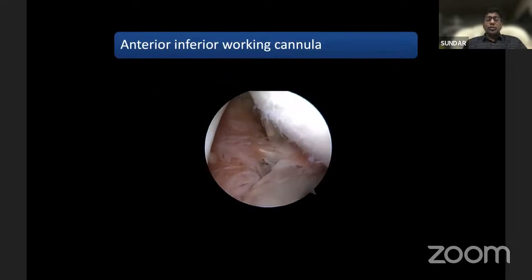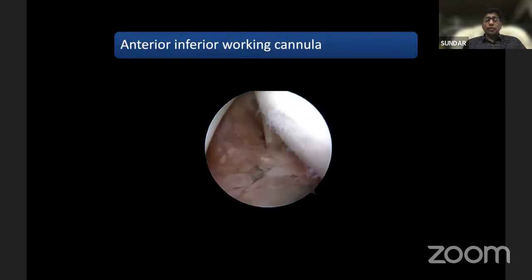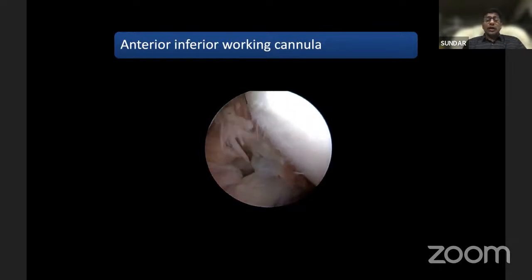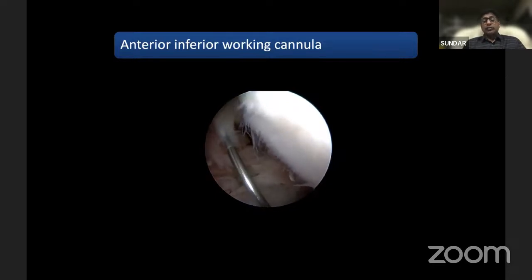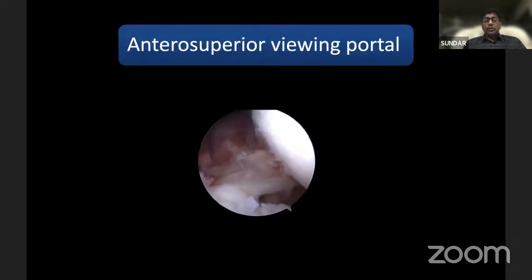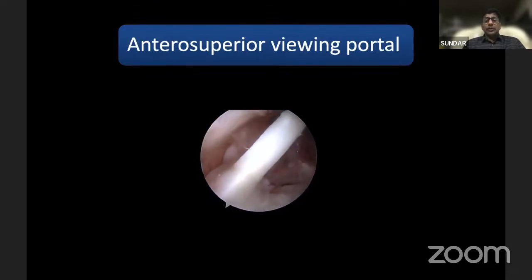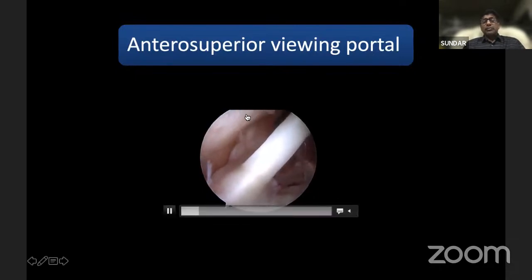Once you are seeing through the posterior portal, you can make an anteroinferior working cannula from lateral to your coracoid, or you can just insert your trocar. You can do a blind procedure also. You can just insert the trocar anteriorly, and you can insert the cannula from there if you are struggling for your anteroinferior working cannula. Then you put a bigger cannula because you require at least 8 mm to get all the instruments inside. Then your anterosuperior cannula comes from just in front of your anterosuperior acromion.